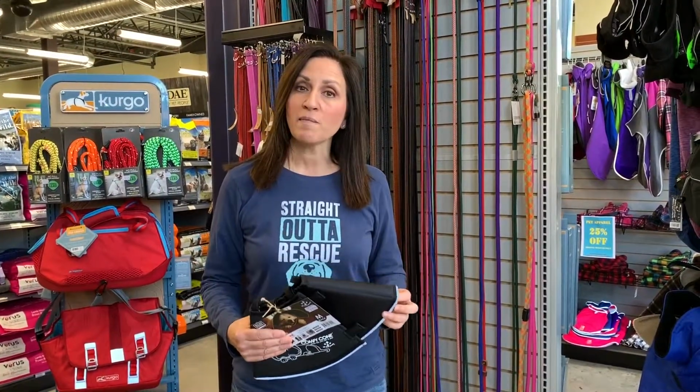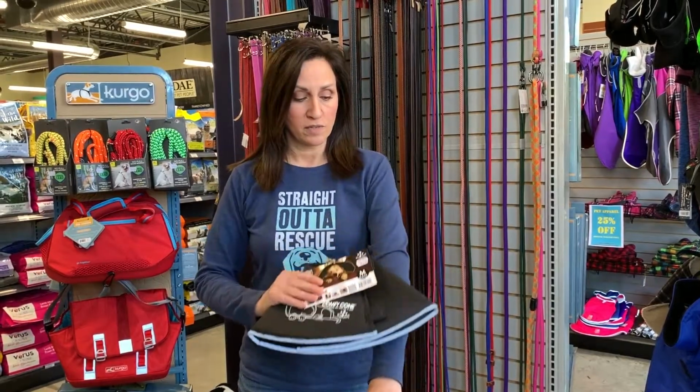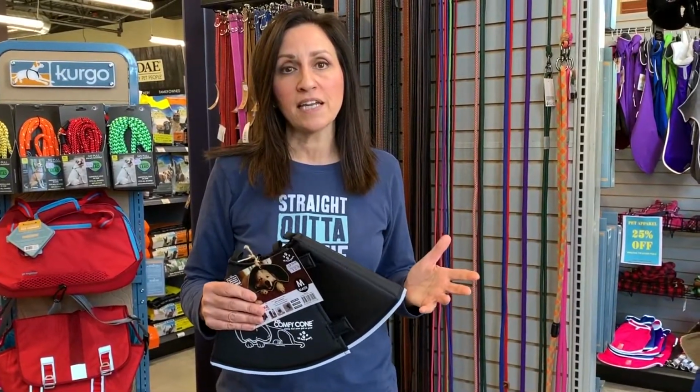One of the best things that you can do is to prepare your dog ahead of time to the smell of these things, the sounds, the sights. And you'll do that by slowly acclimating them each day. And I'm talking about just a few minutes. Put it on them, let them sniff it first. You can kind of touch it to their neck or their side just so they know this thing is okay, it's not gonna hurt you. Give them some treats, give them a little lovin'. Just make them know that it's okay, it's a safe thing.